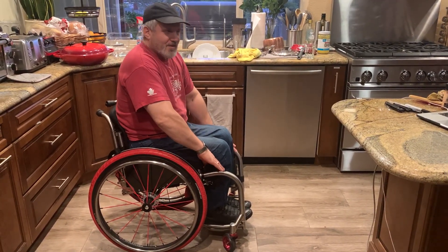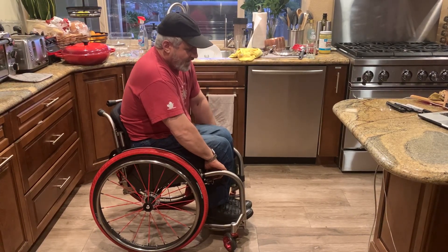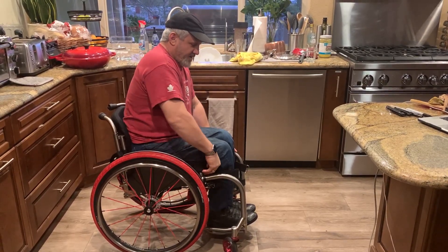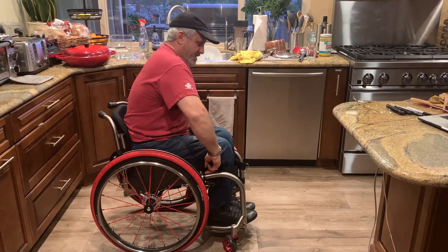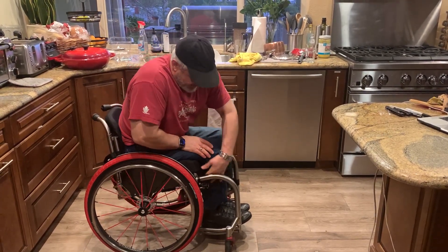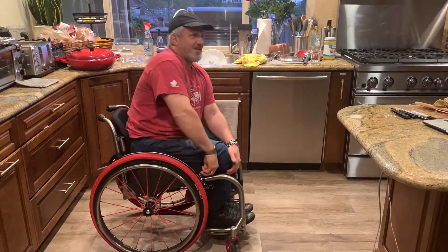Hey YouTube, another one-take video from eBay's YouTube. I finished building this standing chair and I'll show you how I get into it. First part is I'm sitting and I want to stand up.